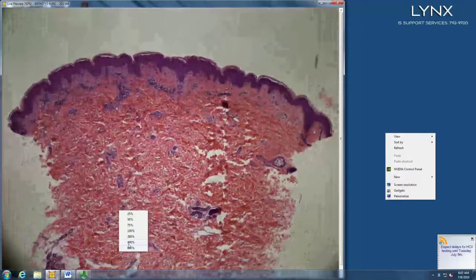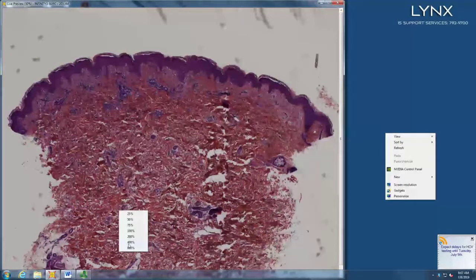I think there's something happening at the DEJ. Yeah, first off, tell me how old the patient is. Oh my goodness, I'm assuming it's young. Is that thick pink collagen or skinny red collagen? Skinny red. So this is a member of the junior set, right? That's kid skin. Okay. So a fair number of fibroblasts, skinny, very red collagen is kid. Okay, so it's kid skin.